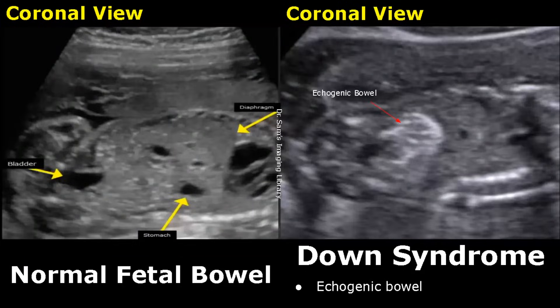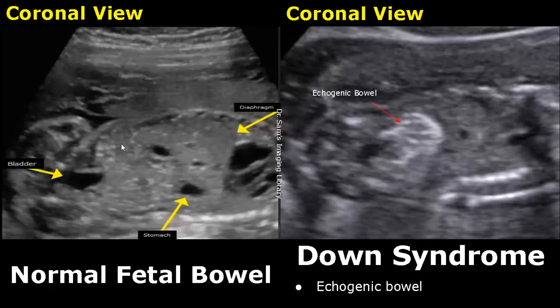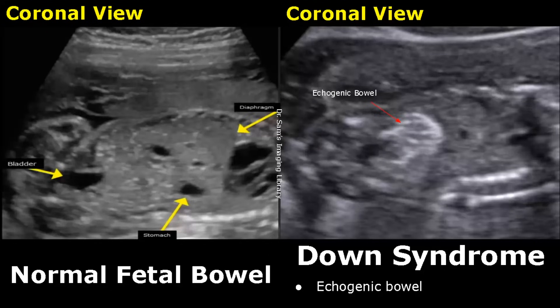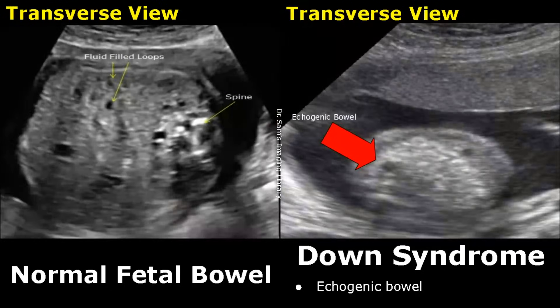This is a coronal image of the fetal bowel; we do not see any hyperechoic region here. Whereas in this image we see echogenic bowel — the bowel is hyperechoic — and this may also be seen in a fetus with Down syndrome. This is a normal small bowel image in a transverse view, and this is an image of echogenic bowel showing a large hyperechoic area.